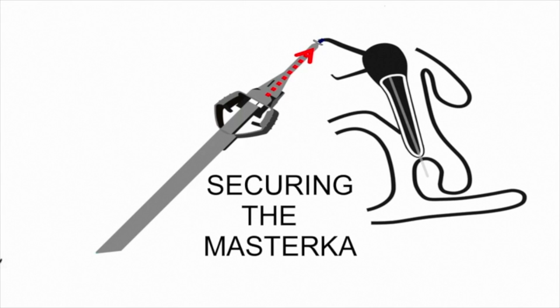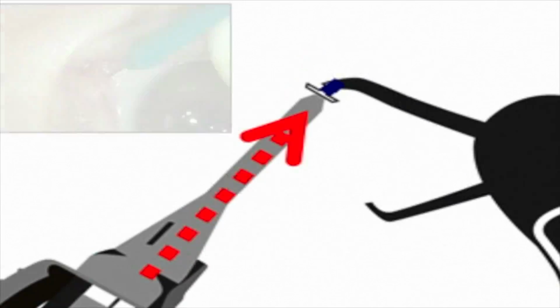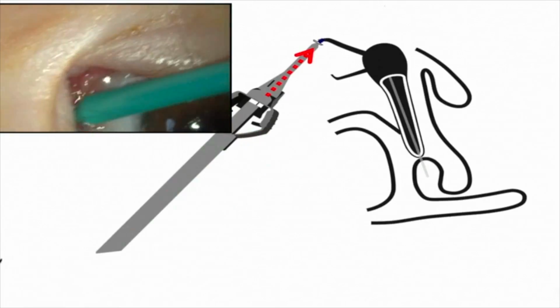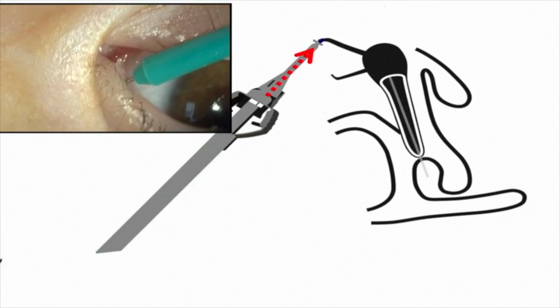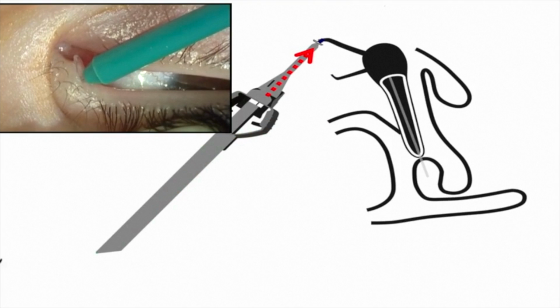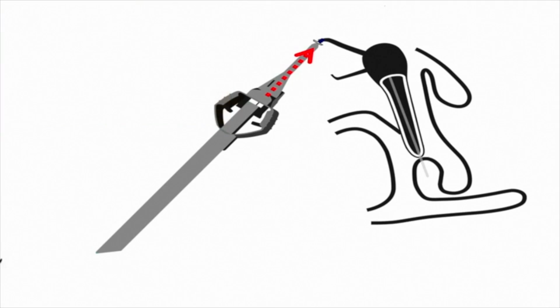Securing the MASTERKA. The fixation head can be engaged within the punctum by using the FCI dilating insertion pin instrument. This procedure is the same as for inserting a standard lacrimal plug. Care must be taken to ensure that the collar is placed uniformly against the palpebral margin. A topical antibiotic ointment is prescribed to be used 3 times daily for 1 week.